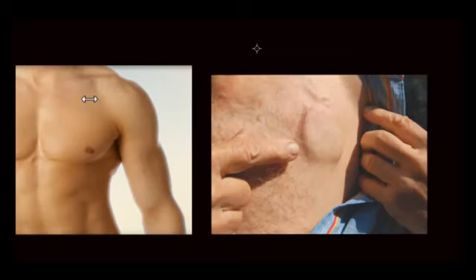When all these parameters are measured and appear to be satisfied, the electrodes are connected to the battery, and the battery is placed underneath the chest muscle, or the pectoralis muscle, and the skin and the subcutaneous tissue are sutured together. When the pacemaker procedure is completed and has healed well, this is how it would look.